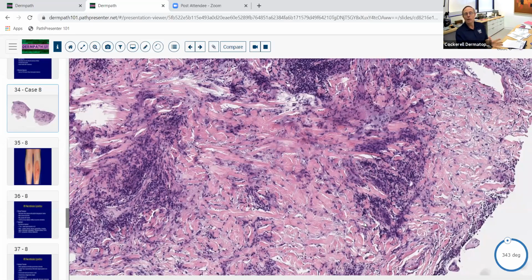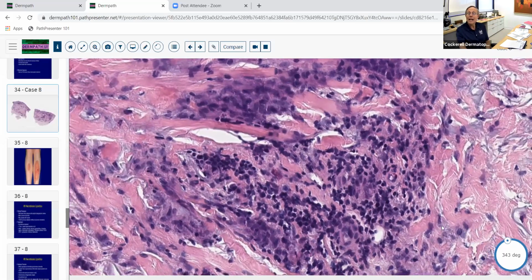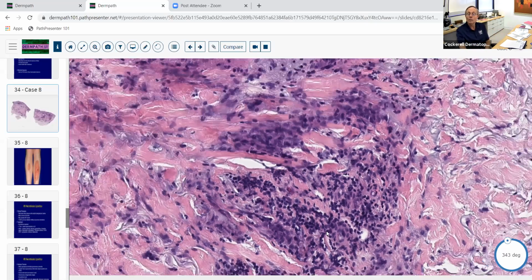It doesn't mean it's necrobiosis lipoidica, because sometimes in granuloma annulare you can get some degenerated collagen, but it's not as common as in necrobiosis lipoidica. Sometimes in NLD you can see some mucin. So again, these are not perfect, but collagen in the center of the palisade, in the center of the treasure chest, if you will, favors NLD. And some other things that help you are if you see plasma cells. Plasma cells love degenerated collagen and sclerotic collagen. They go with it like ham and eggs. You always see it there. I personally think it's a pathologic process that's really related to it that no one's really figured out why, because it's always there. It's in morphea, it's in any of those diseases. But it's always there, and that's a helpful clue.